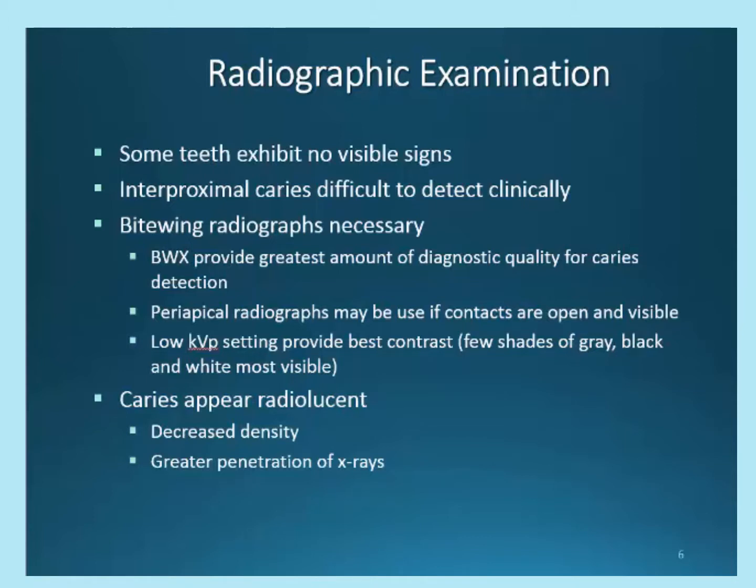If the object being radiographed is void of density, as in having less matter, it will appear darker on the radiograph. When describing the image on a radiograph, we use the same term, lacking density, and therefore it has a darkened appearance. If this concept is difficult to understand, note that this is on slide 6, and I will review this in more detail when we are together in class.